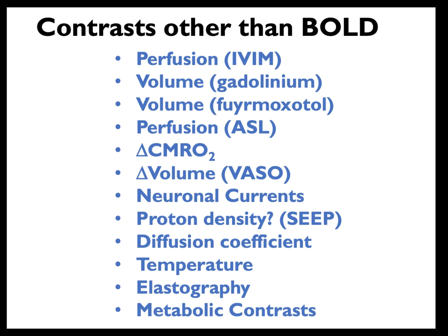Certainly the metabolic imaging might be interesting. As far as activation, not really. But I think the advantage of a lot of these over bold is that you can't get baseline information with bold. You get an image that's weighted by bold, but it's dominated by other tissue. But in perfusion, and potentially in some of these other techniques, like the blood volume techniques and the CMRO2 technique, you get a baseline map of that measure. And so in itself, that's really useful, getting a baseline map of blood volume or perfusion, which you can then compare across populations, whereas bold can't do that. So I think that's a really complementary area in that regard.